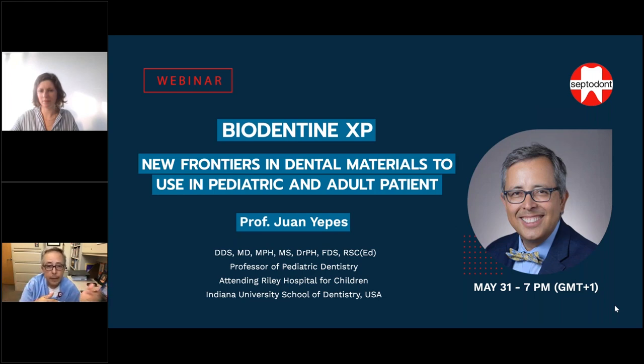The silver diamine is an antimicrobial material, as well as Biodentine. They both have a very high pH, a very alkaline pH. And then over the silver diamine, you place Biodentine. You can do that. So yes, you can use a disinfecting material before placing Biodentine.